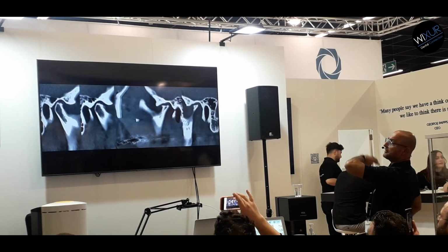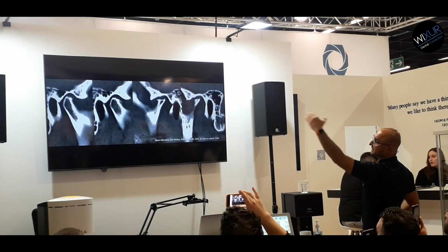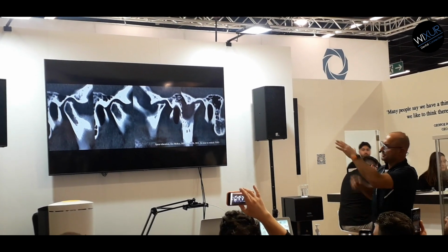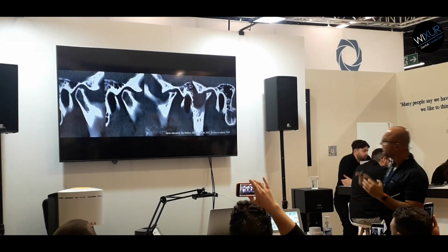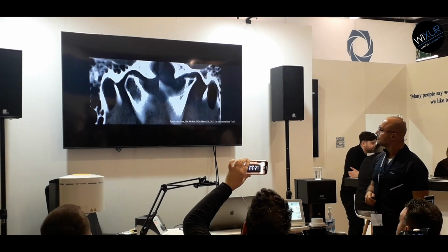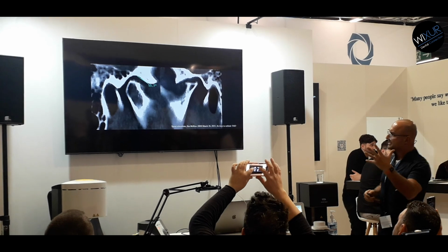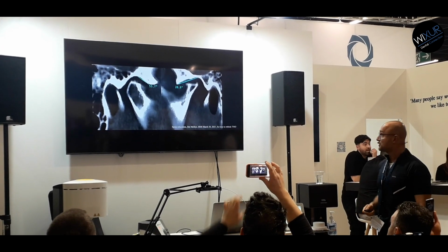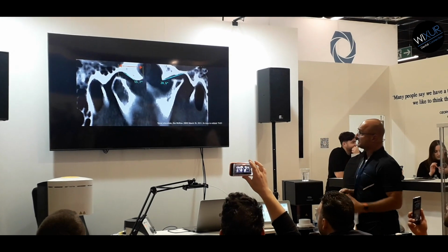Right side, very healthy glenoid fossa, very healthy condyle head, nice corners. But on the left side, we see the flattening. There is flattening, so it means the lower jaw moves differently. You go closer, we make pictures, we can measure everything. You would ask yourself, how do you measure it? Because I give the information to exocad, and exocad can measure everything for me. So we see the anatomy of the right side is different than the left side.